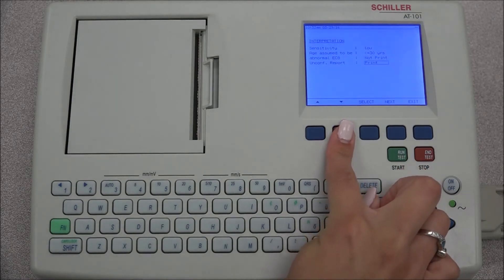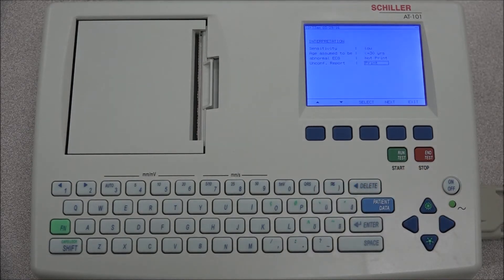The option to have a statement saying abnormal ECG or unconfirmed report in the printout can be selected. If the thrombolysis software is installed, it can be turned on or off under this tab.